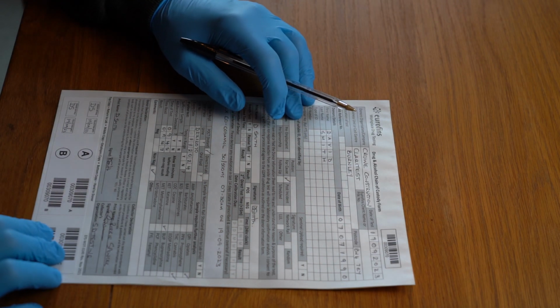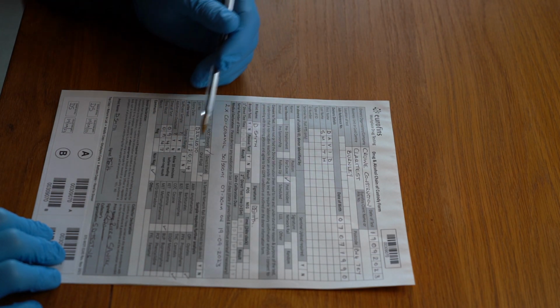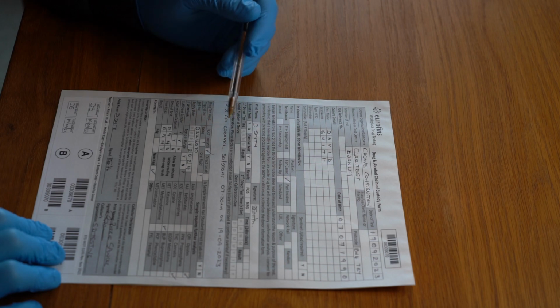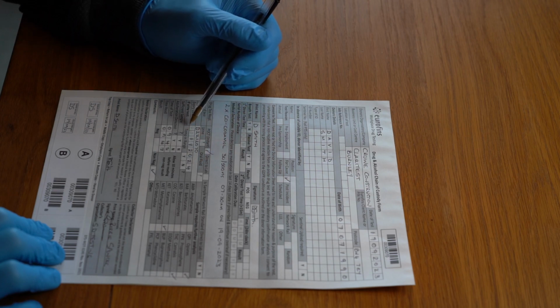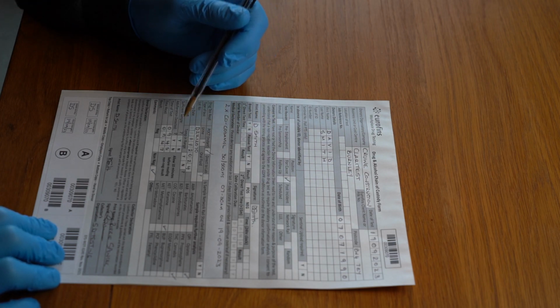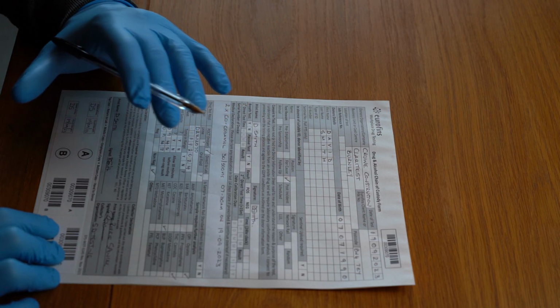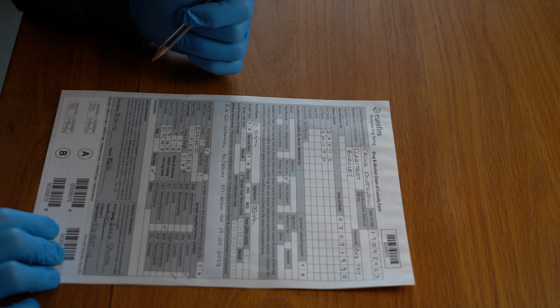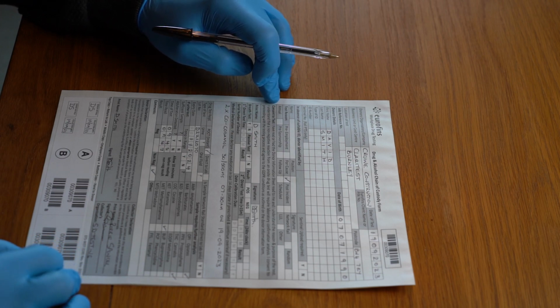If you were doing an oral fluid or saliva chain of custody test, the only differences in the form would be when we get to the POCT part here. It was still a POCT test, point of care test, but instead of urine it was an oral fluid test. I still wrote the lot number and expiry date as I did before. However, now, because it's a saliva test, we're not concerned as to whether the urine was in temperature range or whether there was sufficient sample, because that's non-applicable with this type of test. Apart from that, the rest of this test consent form is exactly the same, whether it be for urine or saliva, and that's how to complete a chain of custody test consent form ready to send off to the laboratory.